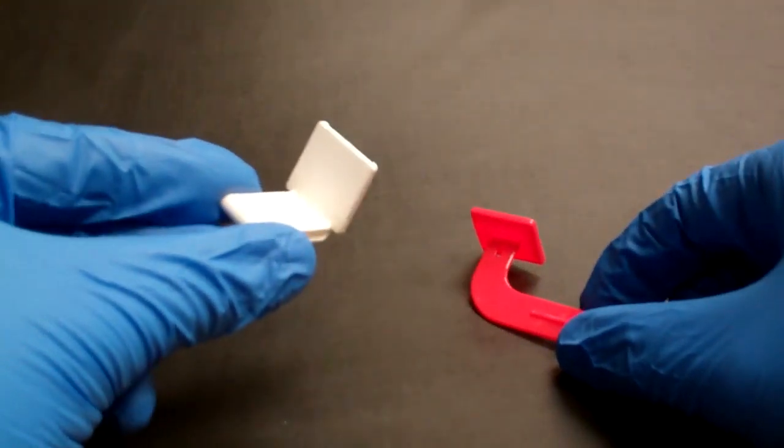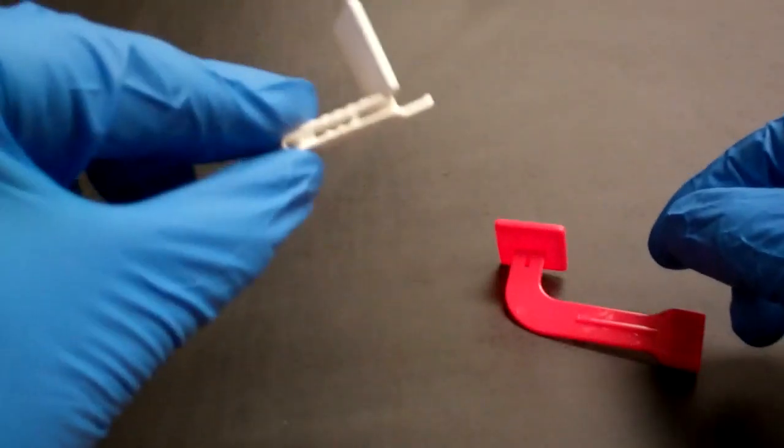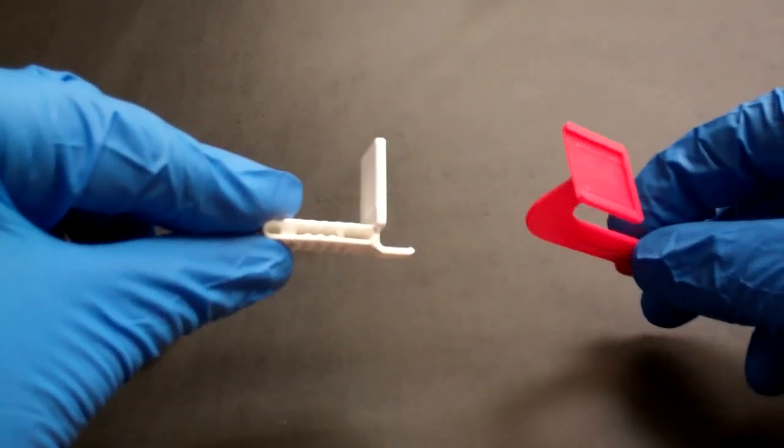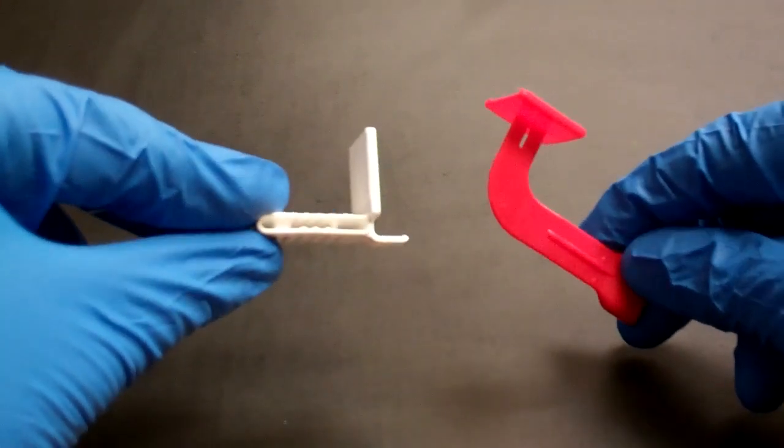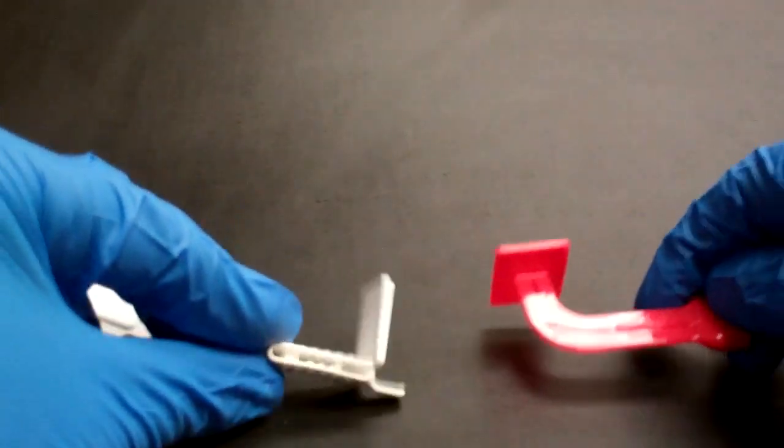One is used for periapicals, and the other for bite wings. Each bite piece can be used for either horizontal or vertical bite wings or periapicals, and I'll show you how that works.